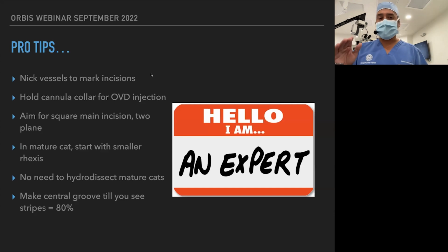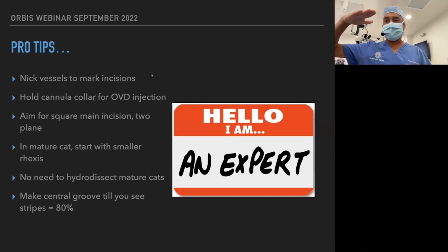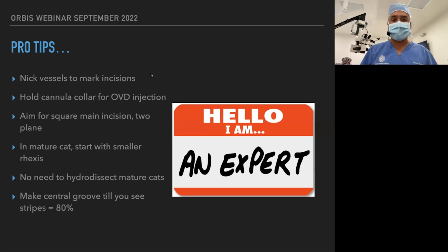And in a mature cataract, start with a smaller capsular rhexis. Like I demonstrated in the last case, you don't necessarily need to hydrodissect mature cataracts. When I was a first year or second year resident, I'll always remember this case. I had a mature cataract and I forcefully injected the hydrodissection, and the nucleus just went beep, boom. I didn't even get a chance to do the case. It fell to the back of the eye. So they have friable capsules. So you do not want to be aggressive with hydrodissection.